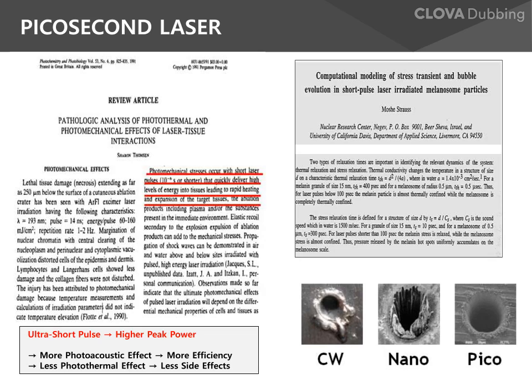In the areas irradiated by lasers, you can see that in the case of the nanosecond laser, the irradiated area is not clean, and there is significant damage to the surrounding tissue. However, the area irradiated by the picosecond laser shows no damage to the surrounding tissue and is cleanly treated. Thus, picosecond lasers enhance efficacy through strong photoacoustic effects and reduce side effects through minimal photothermal effects.